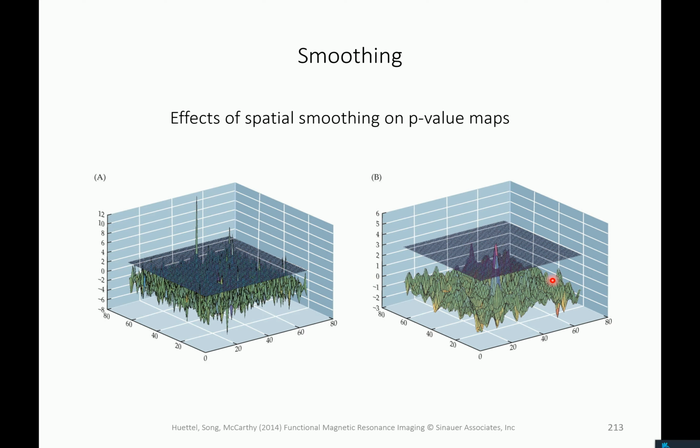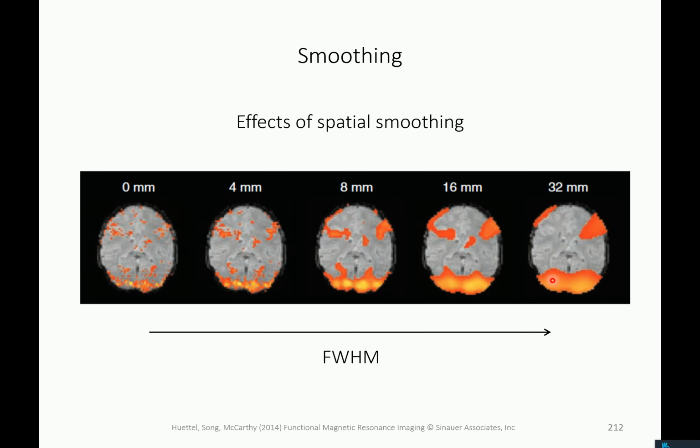We discussed, I think, at one point also this matched filter theorem. One reason why one wants to do smoothing is if one assumes that the activations in the brain actually look a little bit like what you see here. These kind of sub-blobs. Of course, this is not the right representation, you see that better here. That's one way how you can justify smoothing.